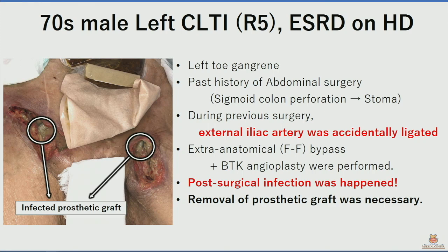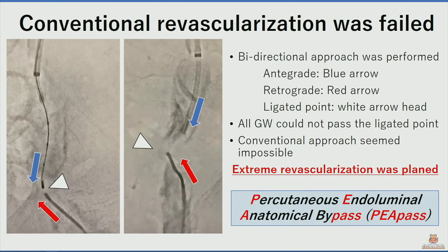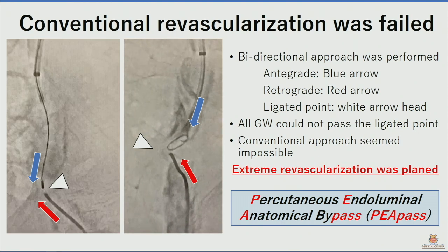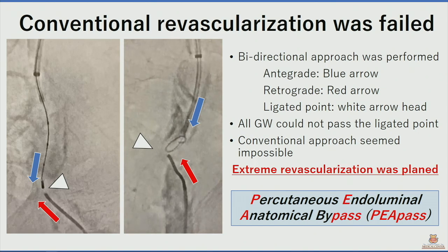However, unfortunately, post-surgical infection occurred. It's really, really terrible. Of course, we should remove the prosthetic graft to control the infection. However, as you can see, it seemed impossible to recanalize this ligated iliac artery. All of the guidewires could not pass the lesions, so every procedure failed.